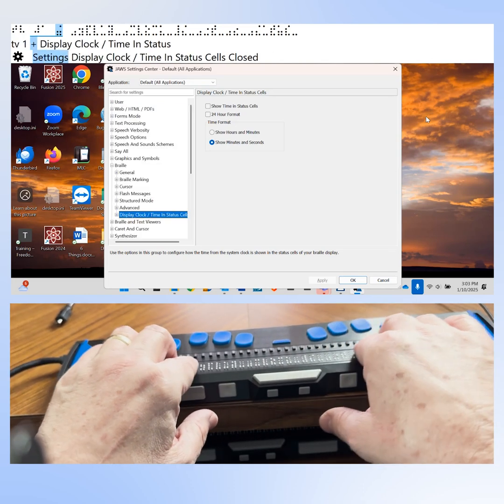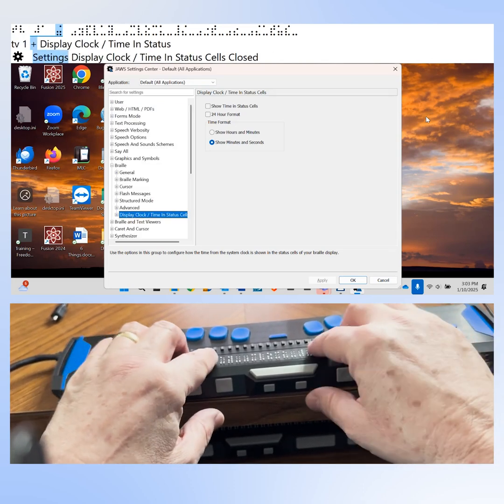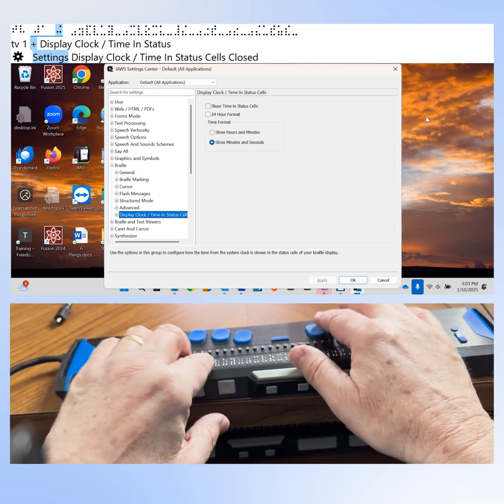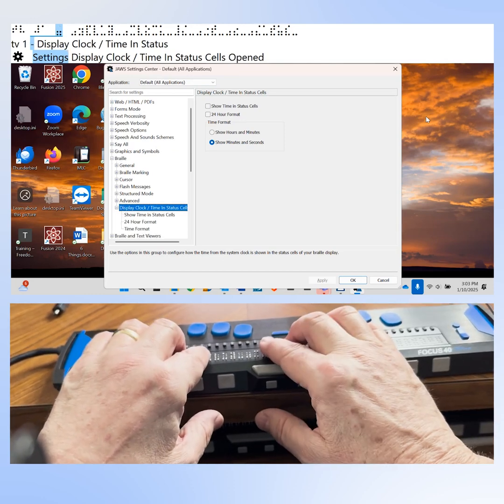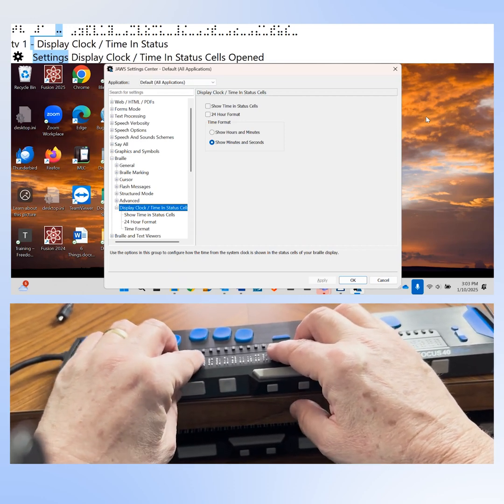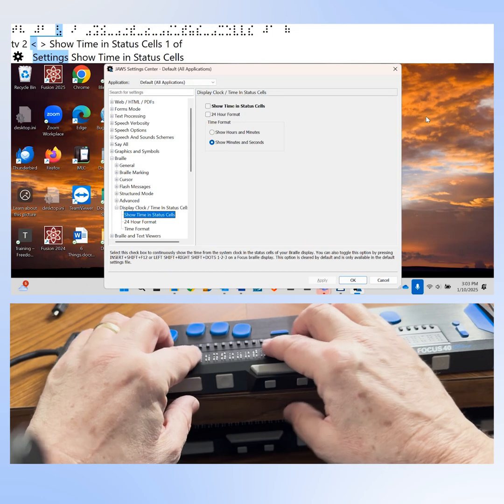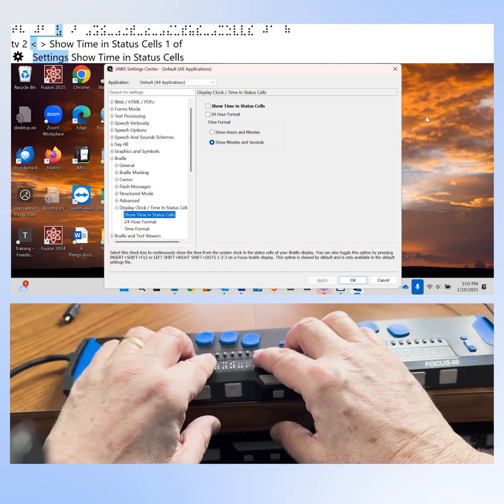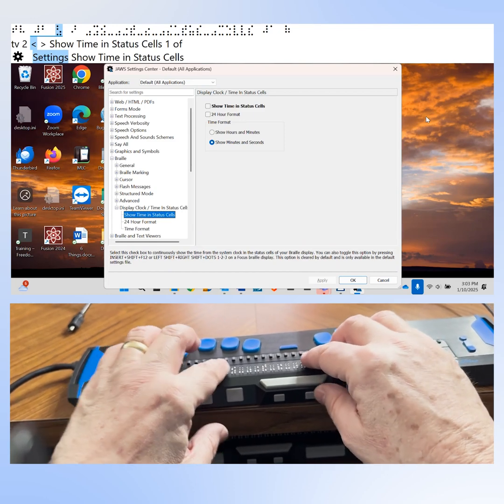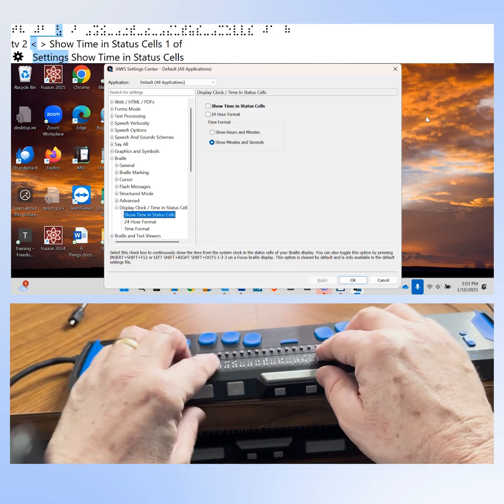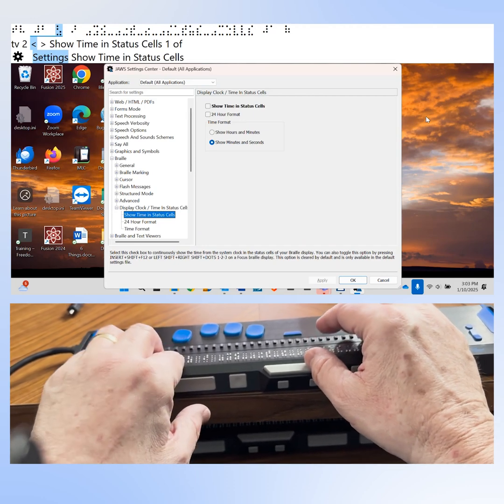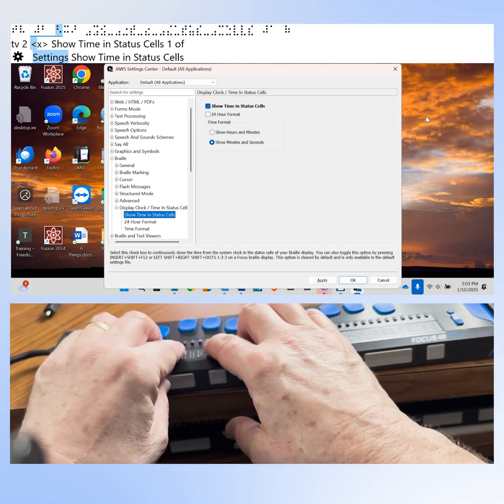The search edit box clears and we're now in the tree view. Display clock/time in status cells is closed with seven items. Let's open this branch of the tree view by pressing right arrow — it now shows three items. Press down arrow to reach "Show time in status cells," which is currently not checked. I'll press the space bar to check this box.